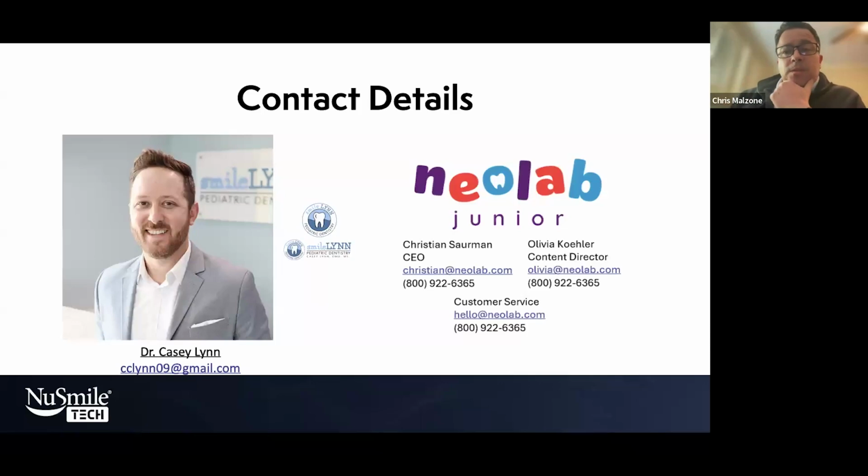Great. Last question, unless there's others. Just some more explanation on clear aligners, Dr. Casey, if you wouldn't mind. How are you doing fabricating appliances compared to clear aligners? Yeah, so the only real difference scanner wise is when you're doing those as part of your record taking, you're going to need a full arch impression in the bite. So you're going to do an upper full palate, you're going to do a lower, and then you're going to take the buccal bites so they get the occlusion.